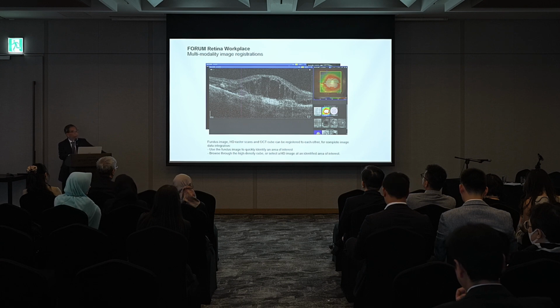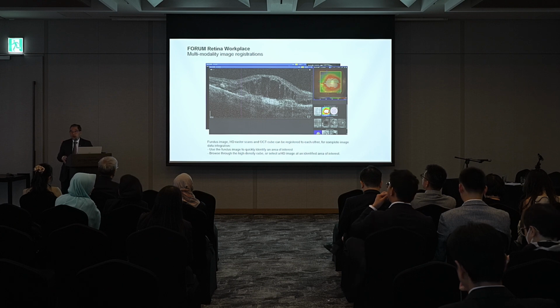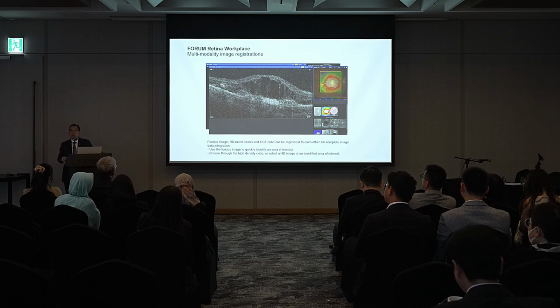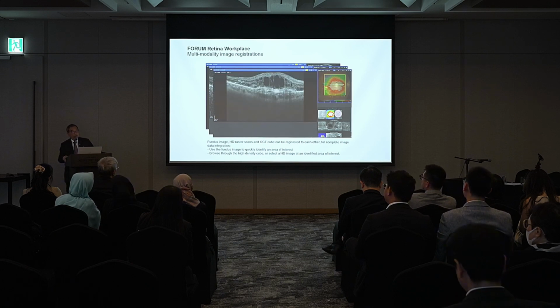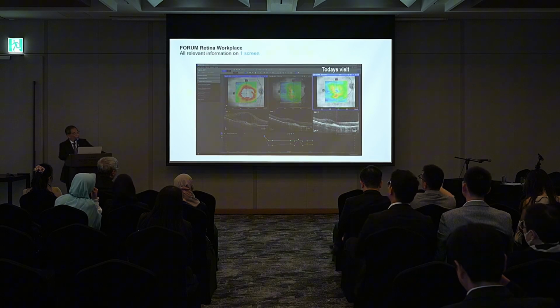So the bedrock of any retina workplace or any similar software is registration. If you cannot compare apples with apples, then whatever conclusions you come to will be, in fact, inaccurate and even misleading. So multimodality image registration is really a very powerful feature of the Retina Workplace.